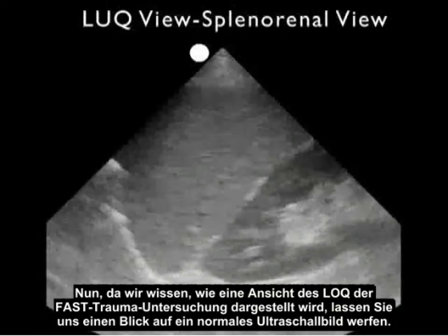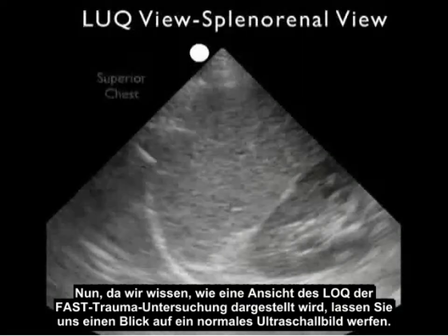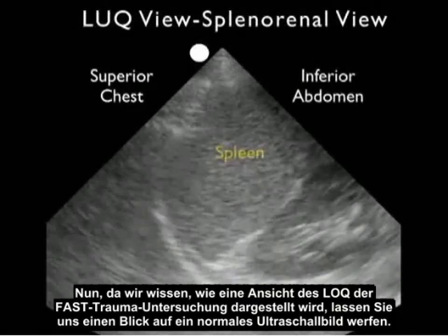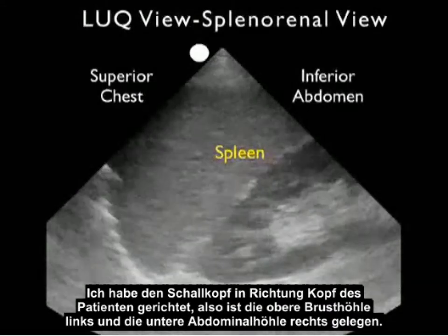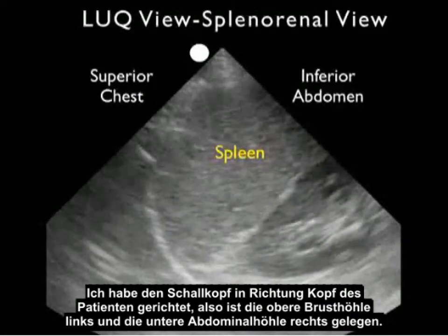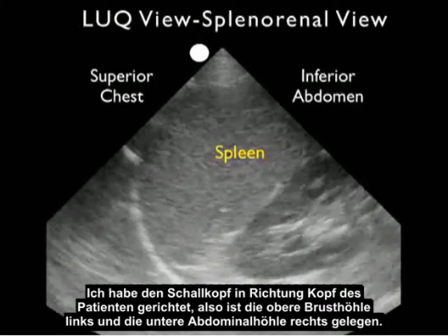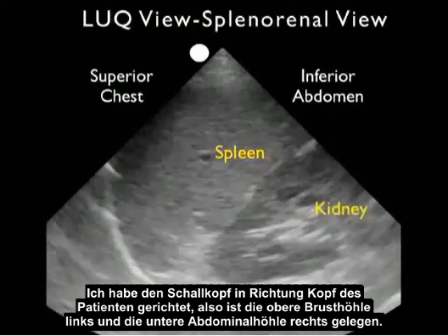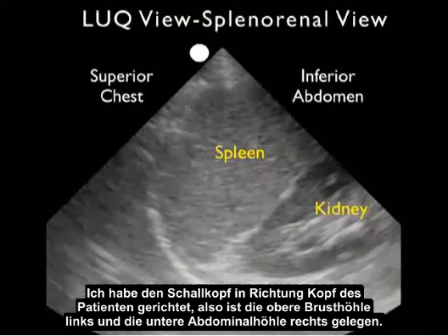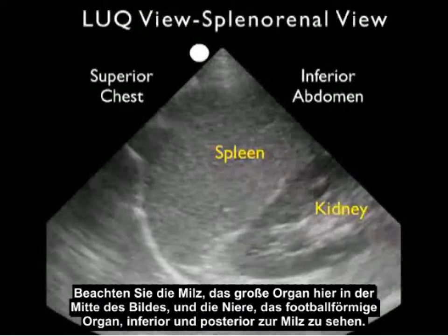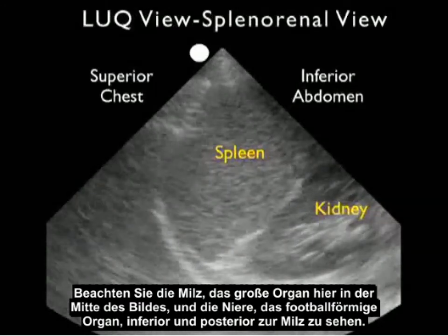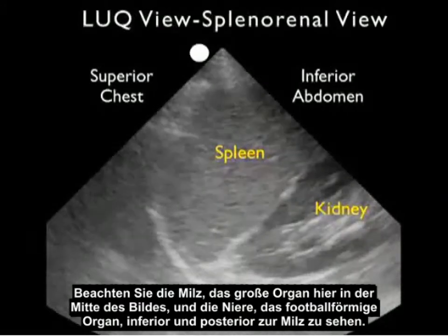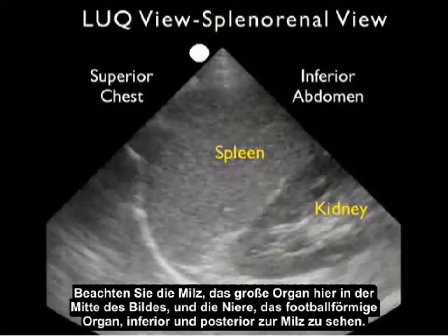Now that we know how to perform the left upper quadrant view, let's take a look at a normal ultrasound image. I have the probe oriented towards the patient's head so the superior chest cavity is towards the left and the inferior abdominal cavity is towards the right. Notice the spleen — the large organ in the middle of the image — and the kidney, the football-shaped organ, seen inferior and posterior to the spleen.